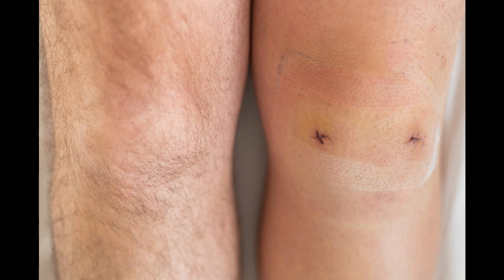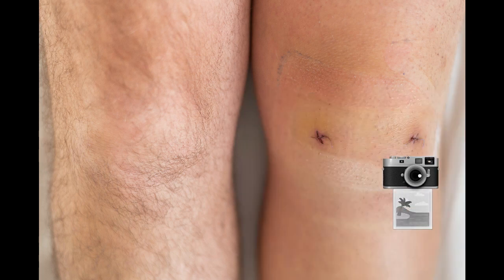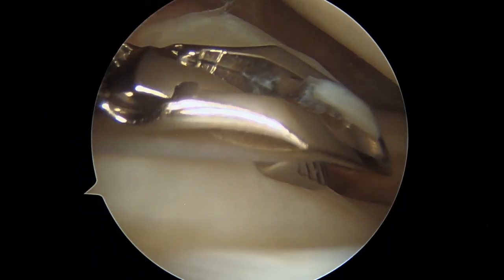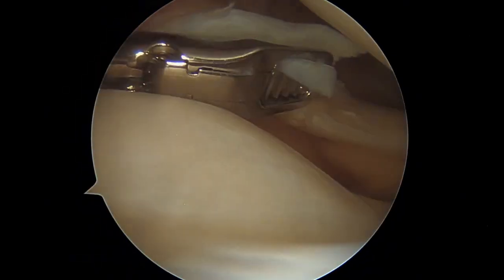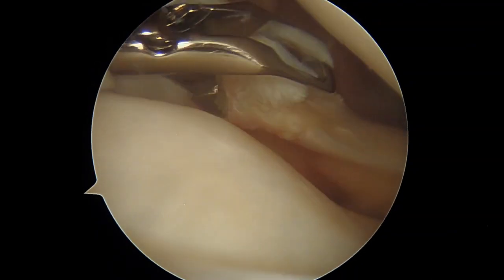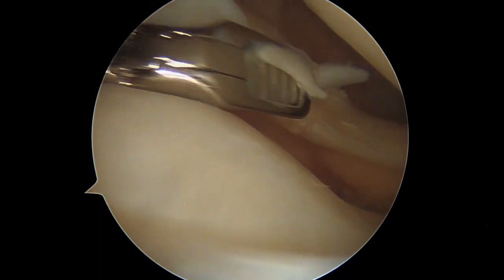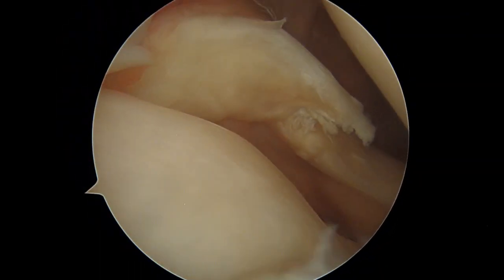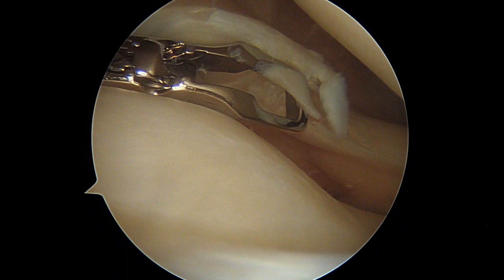Let's turn just for a moment our attention to the arthroscopic portals. We said in our last video that usually we use the anterolateral one in order to put inside our camera and the anteromedial one in order to operate with the instrument. But in this case, it is not a good idea, because the angle of incidence of our surgical tool, in this case the basket, is not good and has a tangent incidence to the meniscal tear and doesn't allow us to have an efficient action on the torn meniscal piece.